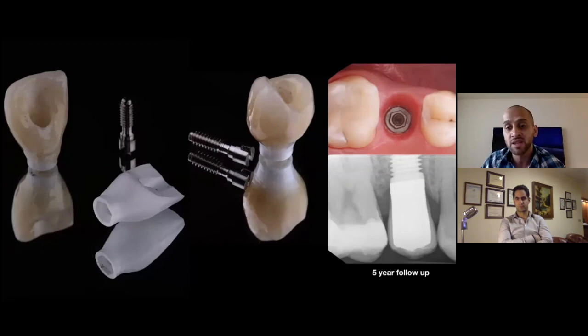And this is an implant that I placed with a 5-year follow-up, one abutment, one time. The implant went in, the final restoration was placed on the day of the surgery, the patient went home, one surgery, and the consecutive appointments in the future will only be follow-up and x-ray appointments. And look at that soft tissue peri-implant health. She came to me after 5 years, I removed the implant crown, and look at that connection, how clean and beautiful that is, and look at the bone levels after 5 years.